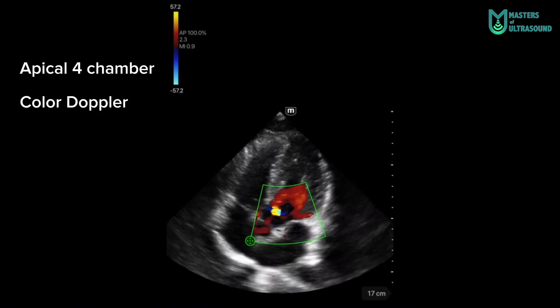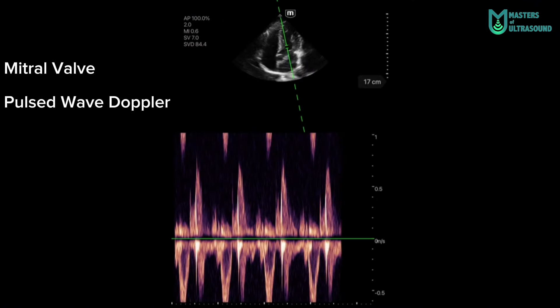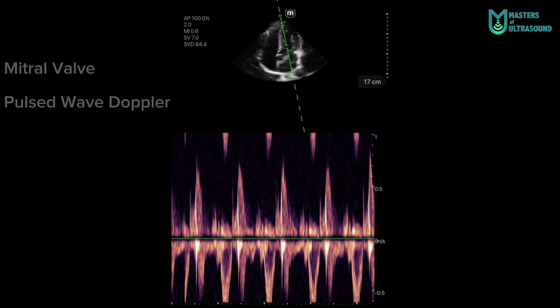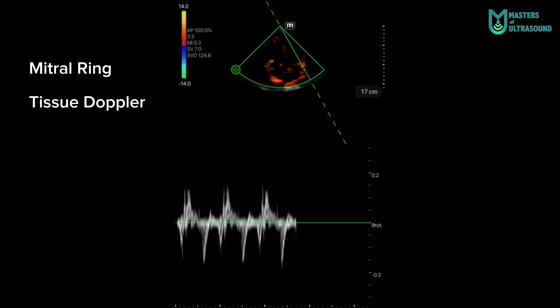You can see no aortic regurgitation. Here you can see a pulse-wave doppler at the mitral valve level, seeing the E wave. And here, a tissue doppler at the lateral mitral ring with the different waves.